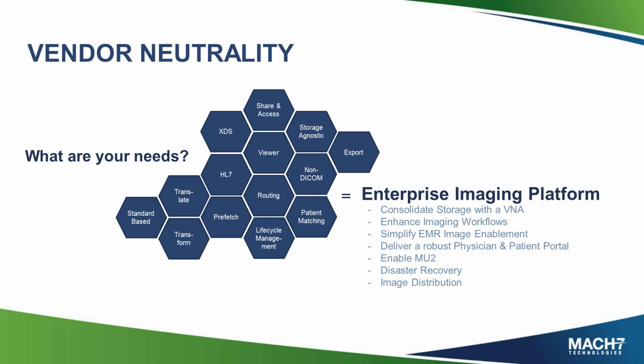There's also some hybrid approaches around, if I've stored a study for more than 2 years, well, maybe I can get rid of the thin slices, but leave the thick slices. So as you look at VNAs, do they have those types of capabilities? And that gets along the lifecycle management, gets into the HL7 piece. VNAs should be able to listen to HL7 and take in patient updates, patient merges, and keep that data clean. It should be able to take in order updates. It should be able to use HL7 messages to trigger different workflows like prefetching and different components like that.